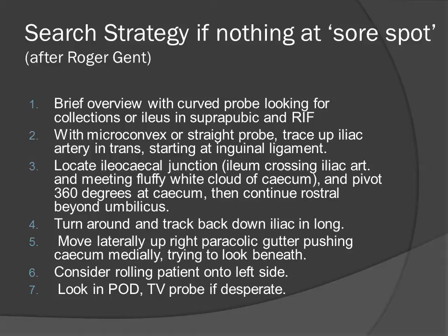Using graded compression may push some of the gas out of the way. If you haven't found the appendix after tracking all the way up the iliac artery, he suggests you then turn in longitudinal and track back down. If you still haven't found anything obviously appendix-ish, you can move laterally and try and push the cecum aside and finally look in the pelvis.